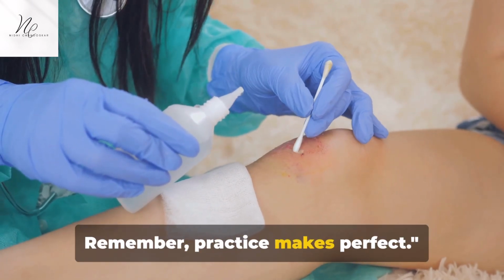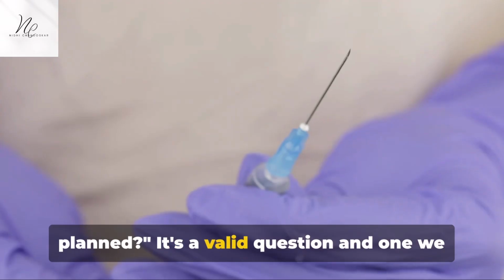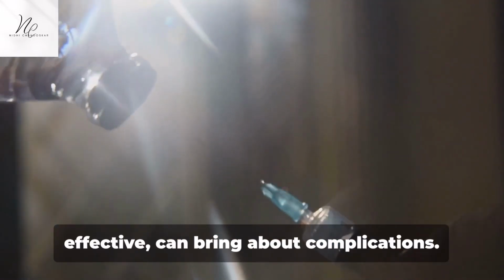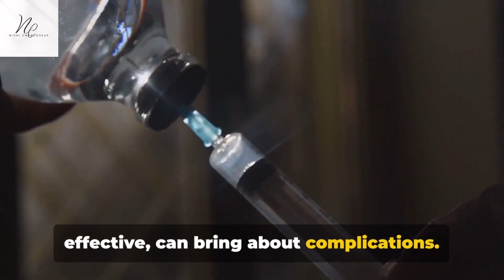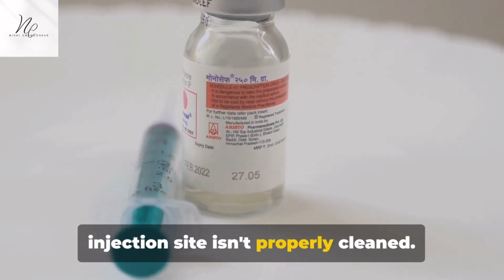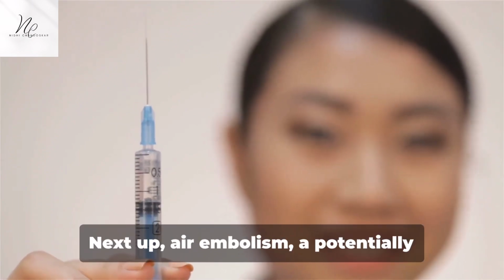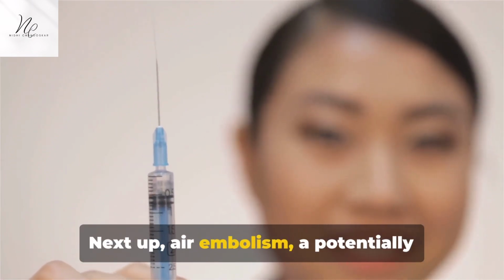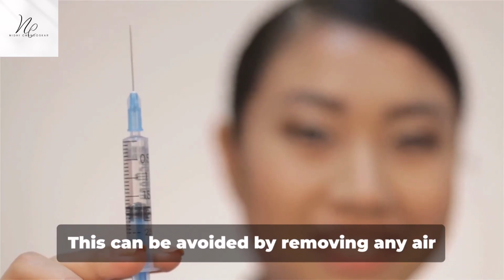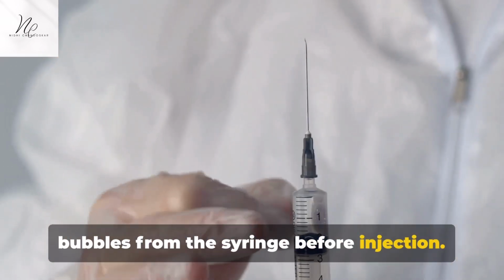Remember, practice makes perfect. But what happens when things don't go as planned? It's a valid question and one we need to address. Intravenous injections, while highly effective, can bring about complications. For instance, infection can occur if the injection site isn't properly cleaned. To avoid this, ensure you sterilize the area thoroughly. Next up, air embolism, a potentially fatal condition where air enters the bloodstream. This can be avoided by removing any air bubbles from the syringe before injection.